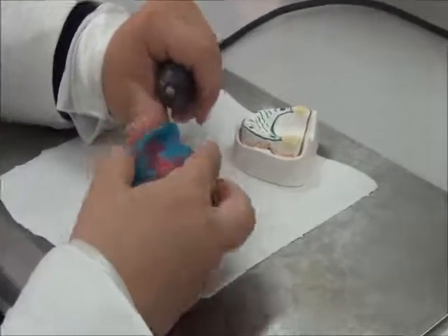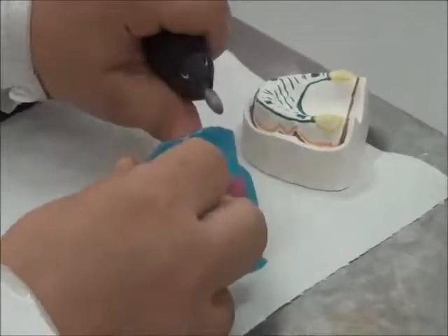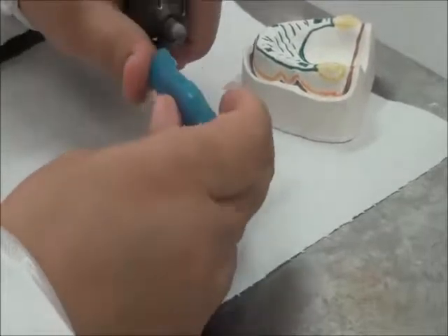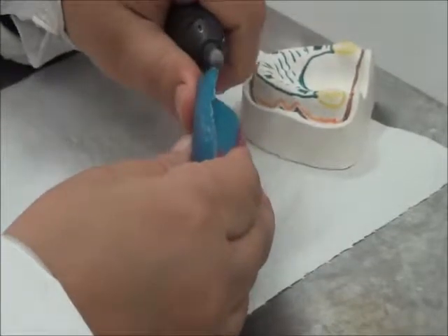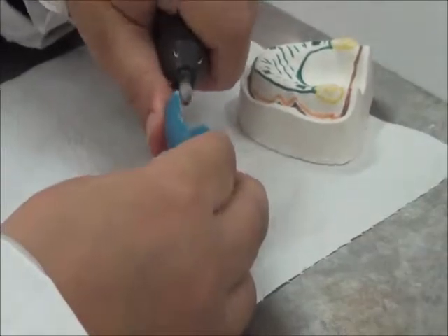So we need to work with the cast. If I'm doing a border, we don't point with the bur onto the surface. We put the full length of the bur on the surface. This is the full length of the bur, and I'm simply running over the border just to remove sharp areas.